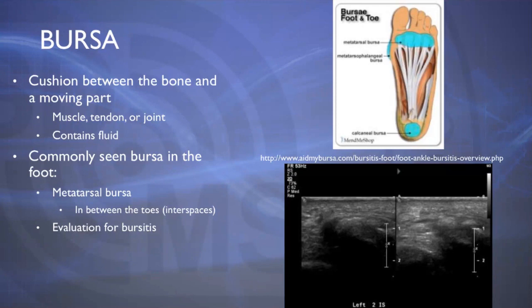The example here in the bottom dual sonographic image is showing you the left second inner space of the foot, and we can see this area that's hypoechoic in nature. There is a nerve coursing right by it, and we wonder, is this area a neuroma or bursitis? If the area compresses and moves and is gone with compression, we know that it's going to be bursitis. A neuroma will persist. So we can see that as we compress, here's the nerve here, we don't get that same hypoechoic area. It completely compressed out, and therefore it was bursitis.